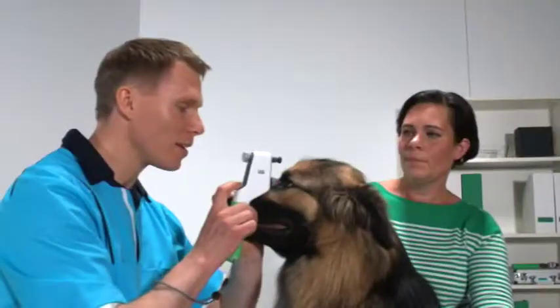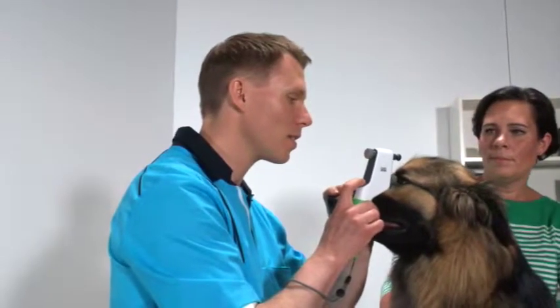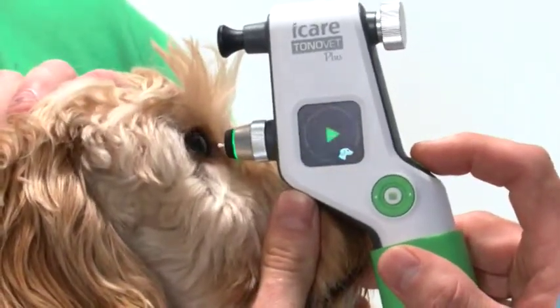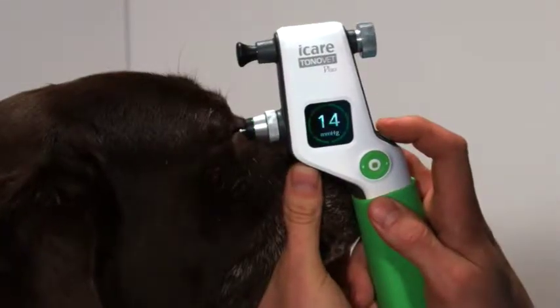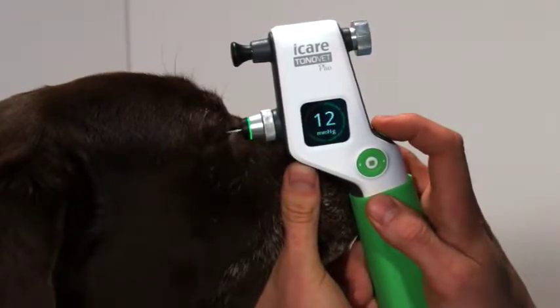Although the animals do not react to the lights, you do have the option to turn them off. Another great new feature is one-touch measurement. With a single push of a button, the device will take six quick readings in succession to create a final average IOP reading. You can still hear the audible beeps, but if you desire, you can also mute the sound.